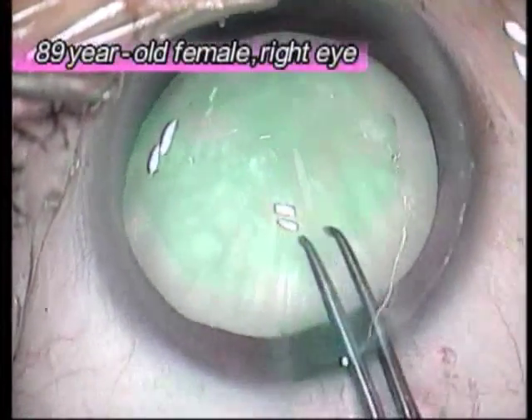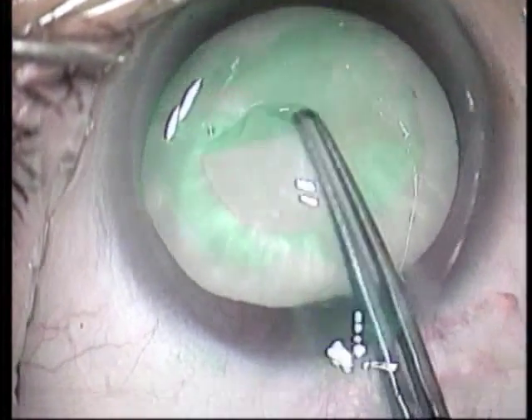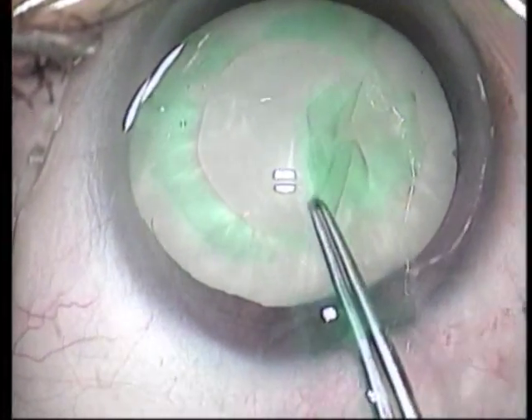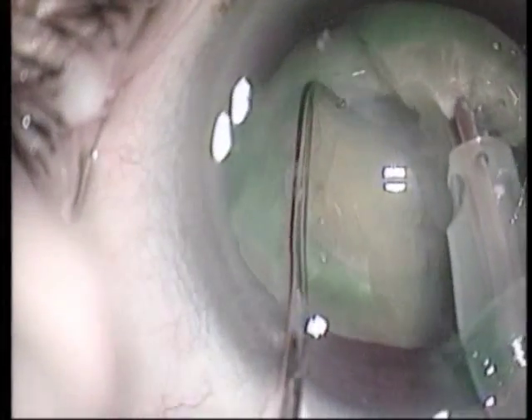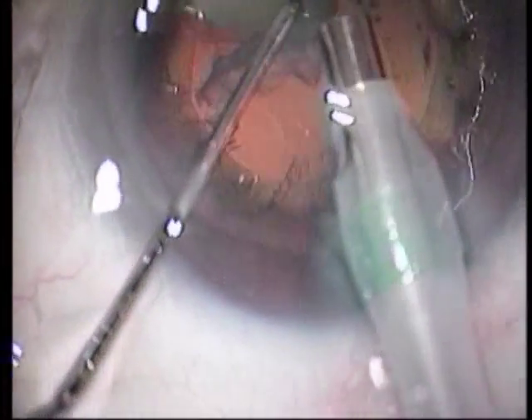Next, the right eye of an 89-year-old female. The CCC is started from the center using forceps, and Visco-ICG is used to stain the anterior capsule. After dividing the hard nucleus, it is phacoemulsified and aspirated by a US tip with phacochopper. The remaining half of the nucleus is rotated clockwise, and chopping and PEA are performed. The last portion of the nucleus is then phacoemulsified and aspirated.